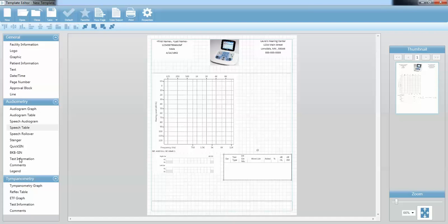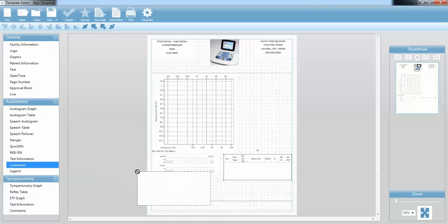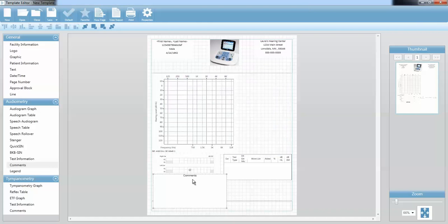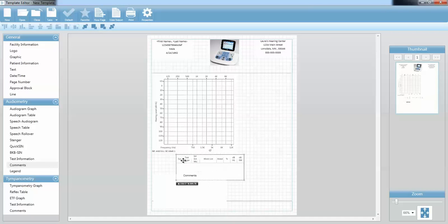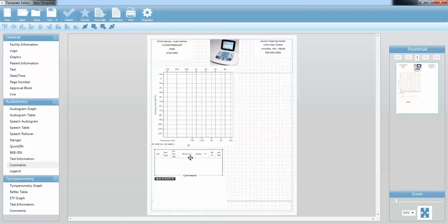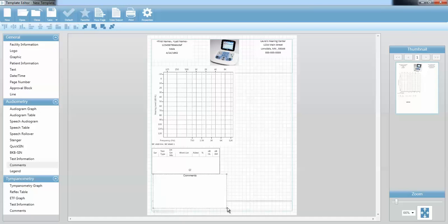The next thing I'm going to do is drag over my comments component. I'm going to double-click that — I can display the header on that and call it whatever I want, so I'm going to leave it as Comments and press OK. I'm going to move my speech information right under my audiogram and then expand my comments over here.